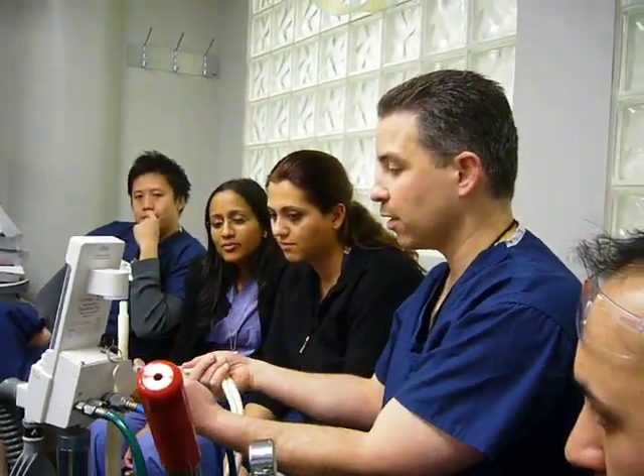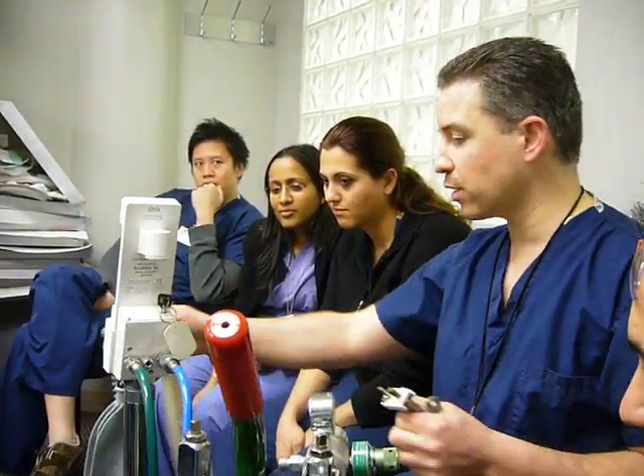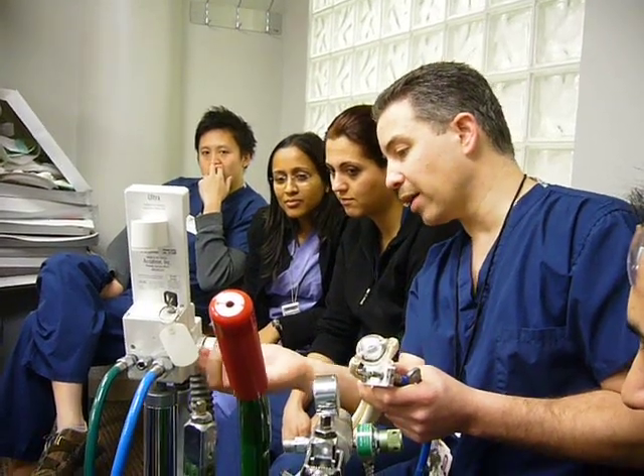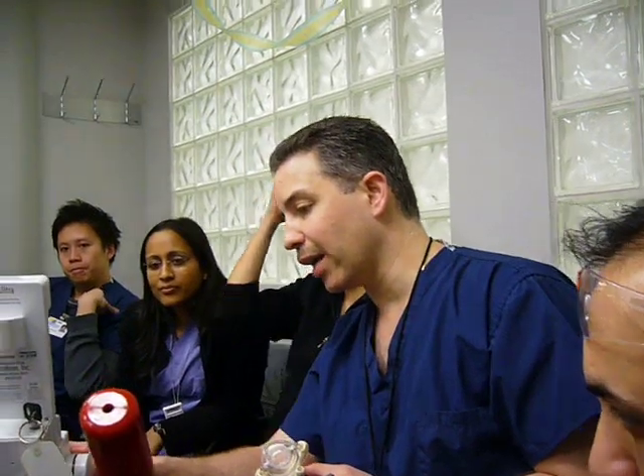Everybody knows how to hook up the mask for the scavenger, but in this case if you're using it just for oxygen, you can just turn on the oxygen. You don't have to keep the dial for O2 to 0 — you would just turn the dial up, or again your flow meter, same as this here.